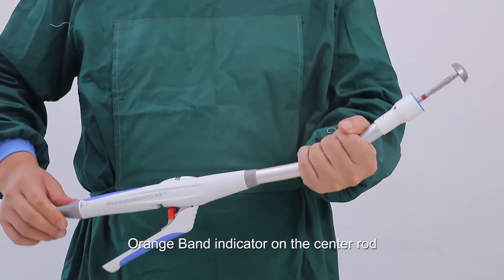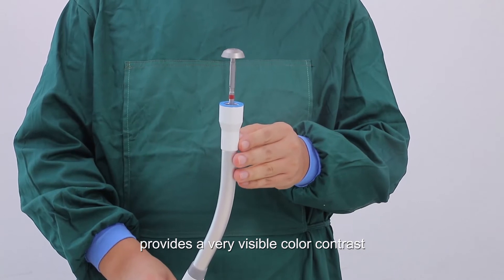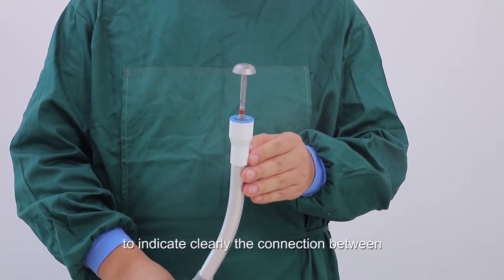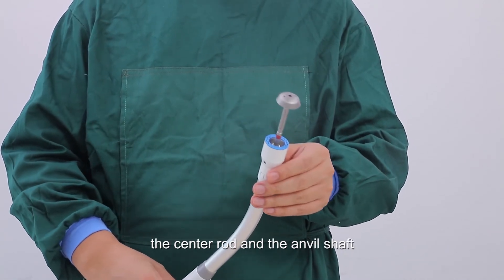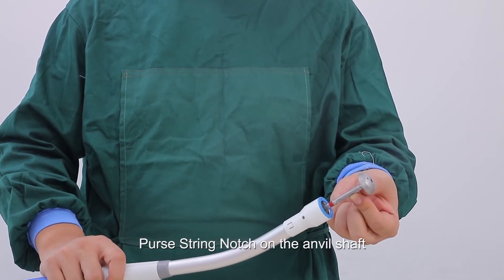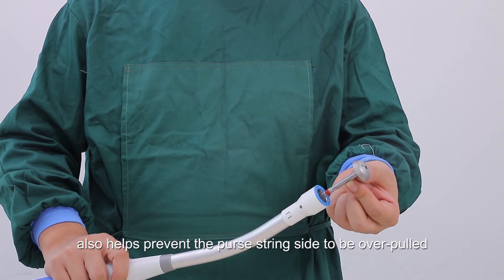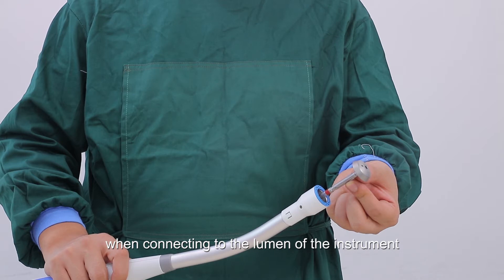An orange band indicator on the center rod provides a very visible color contrast to clearly indicate the connection between the center rod and the anvil shaft. A purse string notch on the anvil shaft facilitates making purse strings and helps prevent the purse string side from being over-pulled when connecting to the lumen of the instrument, which could affect staple formation.